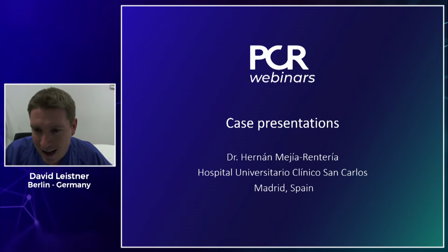And with this, I hopefully give you an impression of my top 3 indications where I see QFR in the clinical routine. Thank you.